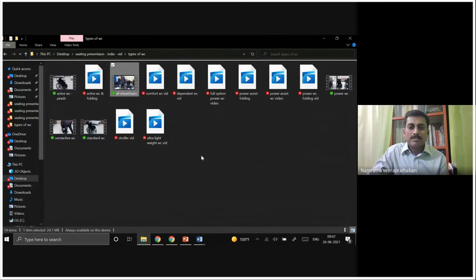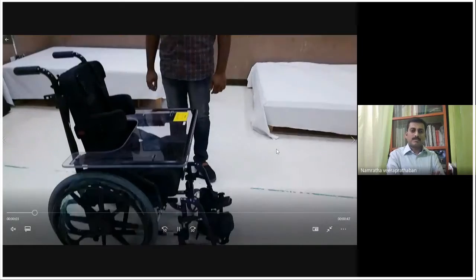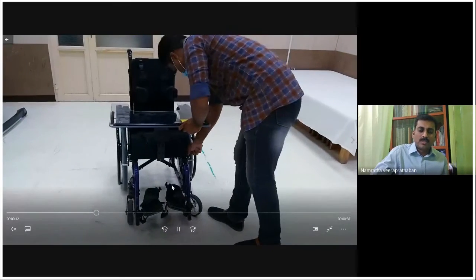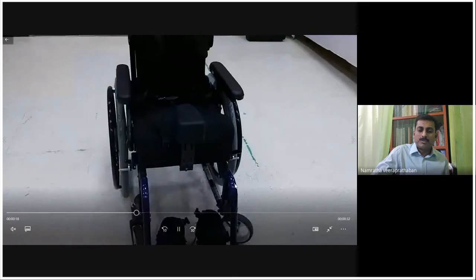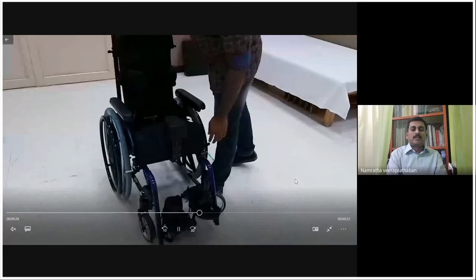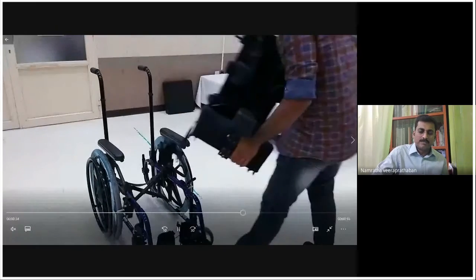Now, let's start from independent wheelchair. Independent wheelchair, first, the wheelchair types we said, semi-active. Am I right? Yes. So this is the model of the semi-active wheelchair, this is what we showed in the picture. That is the pediatrics, and this is for adult. It can be for the teenage also. Look how it looks like. The rear wheels and the hangers. First, look at the mobility base, types of armrest and the back post, the caster, everything. And he is going to remove the seating system alone now. Seating system, you see cushion, the backrest, lateral support, abductors, everything.